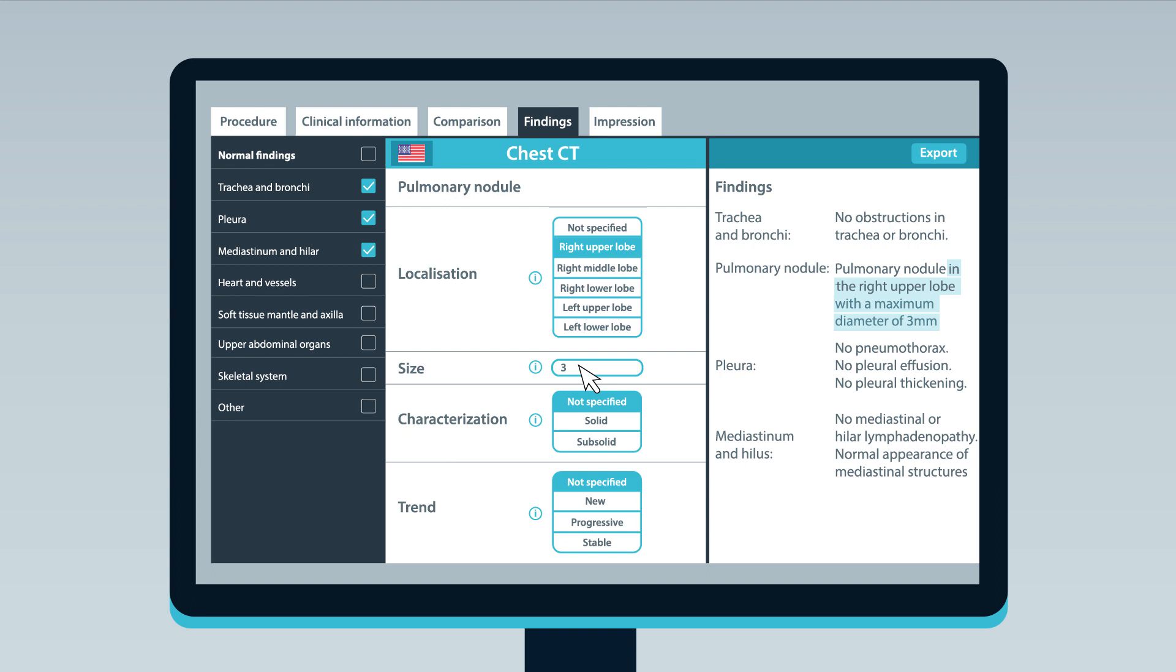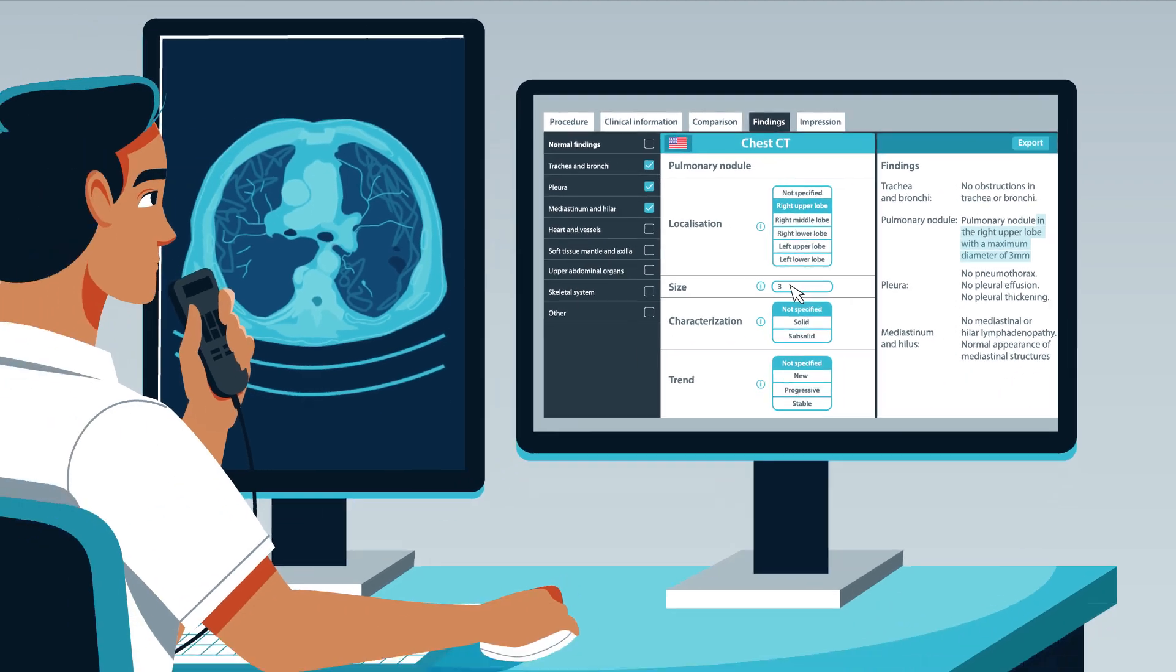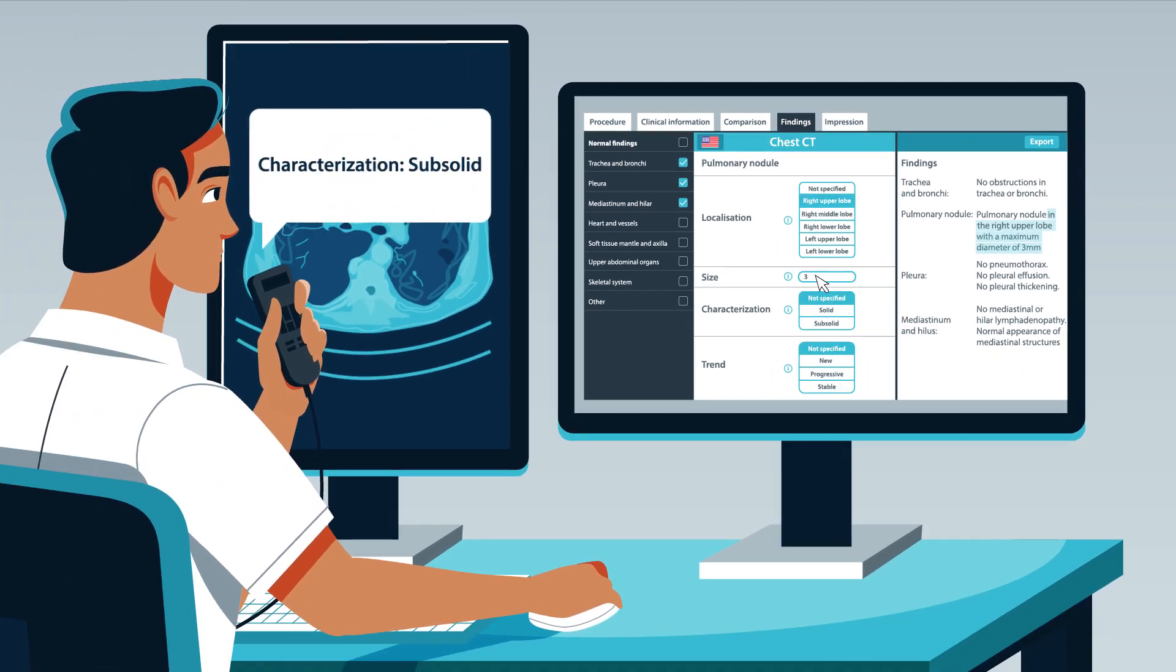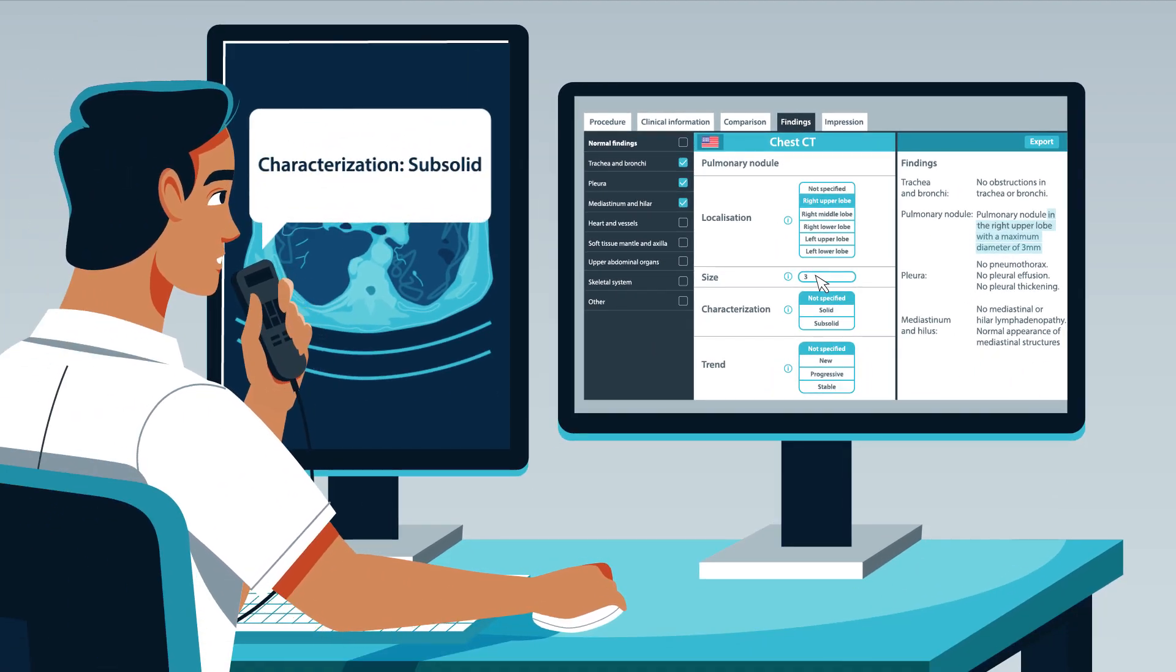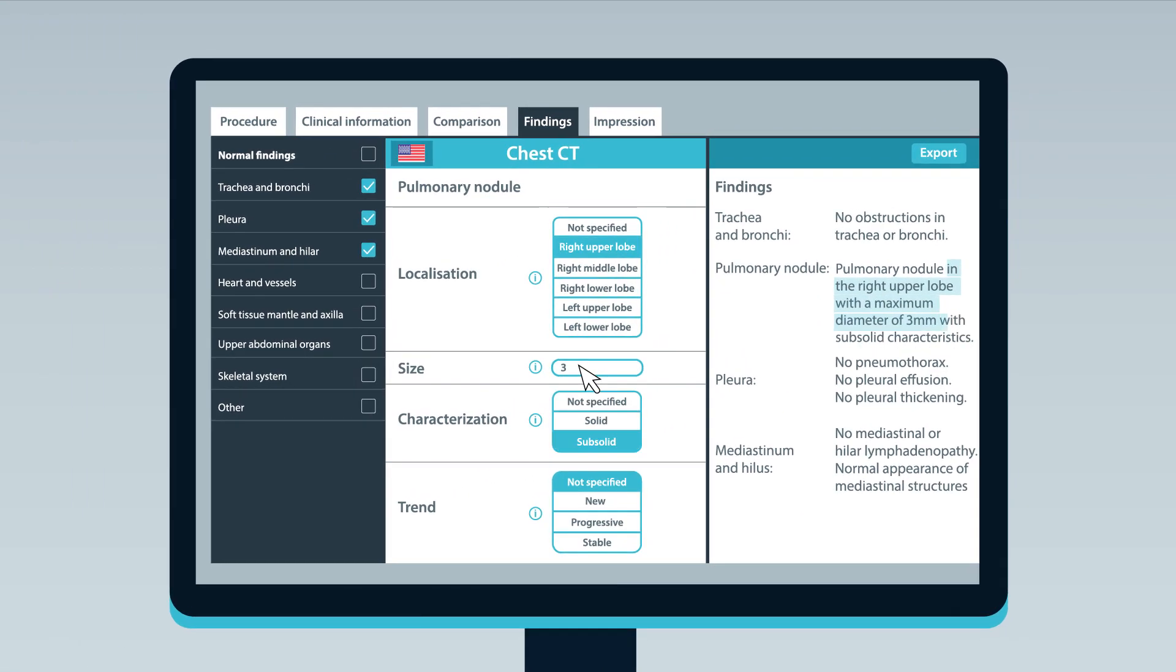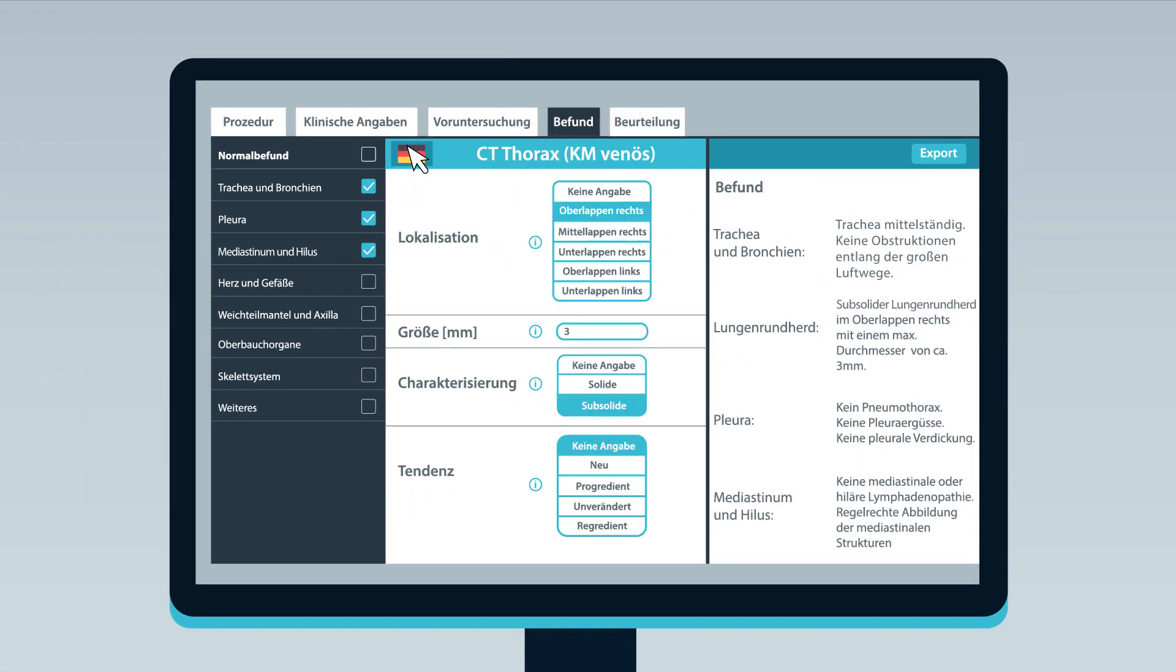You can use your existing speech mic to add free text or to navigate the simple templates, and the corresponding report text is generated instantaneously as you work. With a single click, reports can be translated into multiple languages.